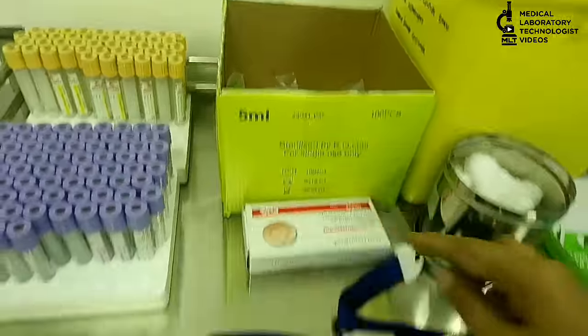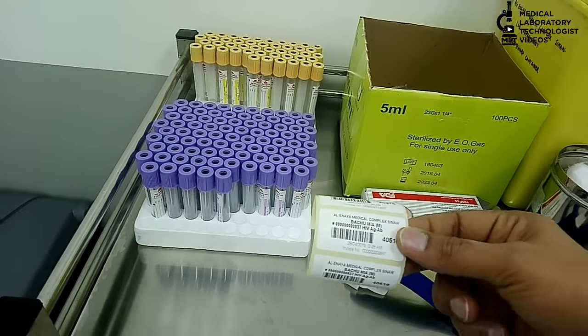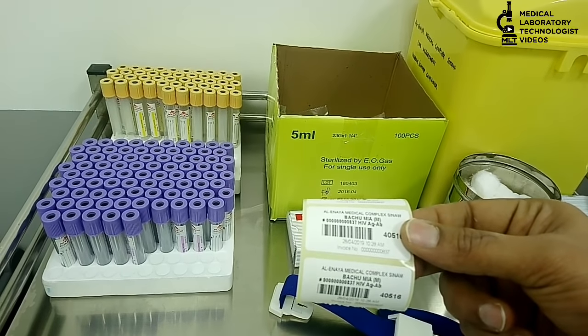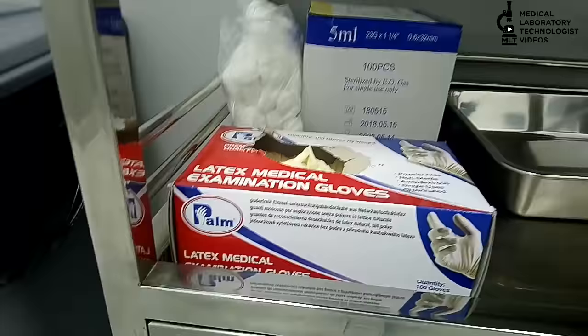Spot bandage. Tourniquet. Then, barcode — this barcode you can attach to the bottles. If a barcode is not available, you can write the patient name and file number on the bottle. Then, gloves.